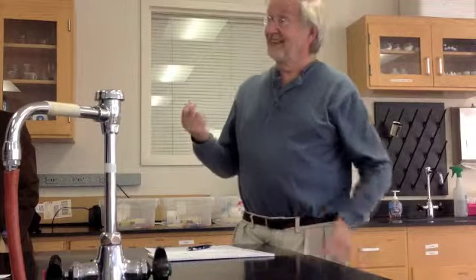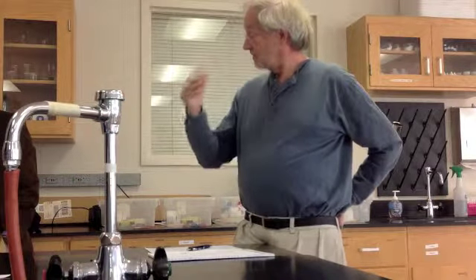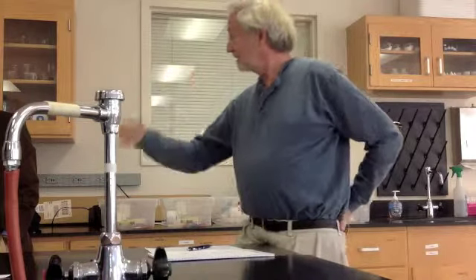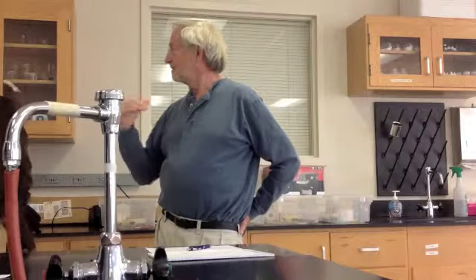That's less sophisticated, but it's also cheaper. And it's probably, for this, maybe all that's necessary. That you just go from a half a liter a minute to a liter a minute, a minute and a half a minute. You just have 5, 6, 7 different digital, discrete oxygen delivery levels.